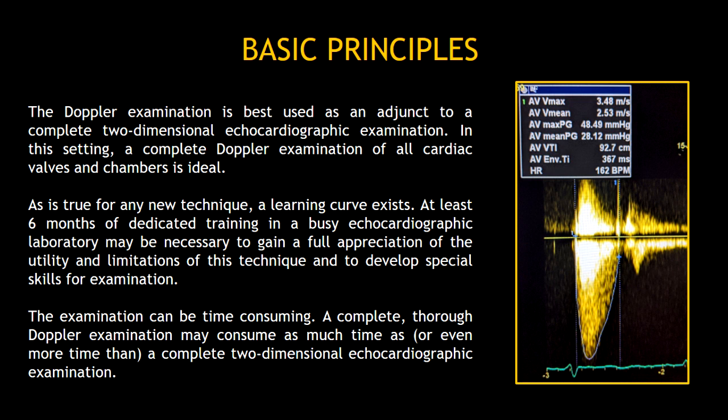At least 6 months of dedicated training in a busy echo lab may be necessary to gain a full appreciation of the utility and limitations of this technique, and also to develop special skills for examination. The examination can be time-consuming, and a complete Doppler examination may consume as much time as a complete two-dimensional echocardiographic examination.